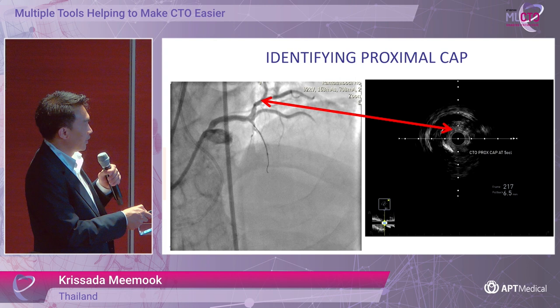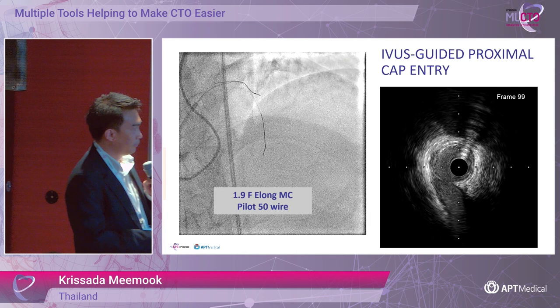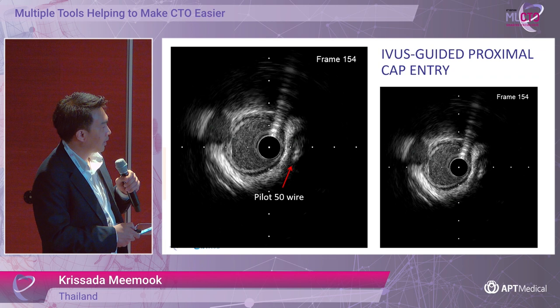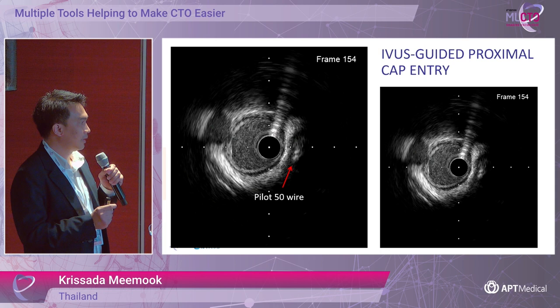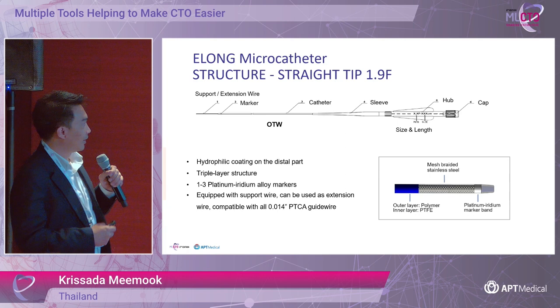So we put the ELONG microcatheter with the Pilot 50 wire to puncture the proximal cap. This is the IVUS real-time image as we pull back from the septal branch. Now you can see the Pilot 50 wire going into the intimal part of the CTO. I think this is inside the vessel wall, so we advanced the microcatheter into the CTO segment. This is an example of the ELONG microcatheter.